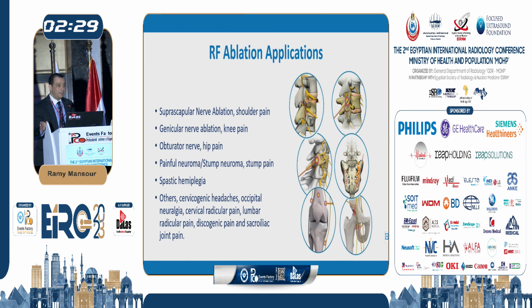So now we'll just go through some applications, which was already nicely done by my colleague in the beginning of this session. So you can see there is a long list of radiofrequency ablation applications. It's becoming very, very popular, by the way, especially during the COVID-19 pandemic. In the UK, there was a restriction on injecting steroids because they were worried that steroids would reduce immunity and increase the patient's susceptibility to the virus. That's why all of the hospitals and centers like ourselves started using radiofrequency ablation rather than steroid injections. And since then, it has become more and more effective and used more.